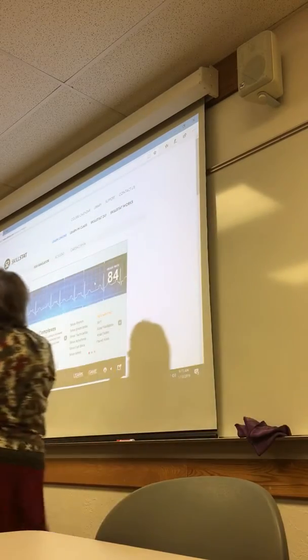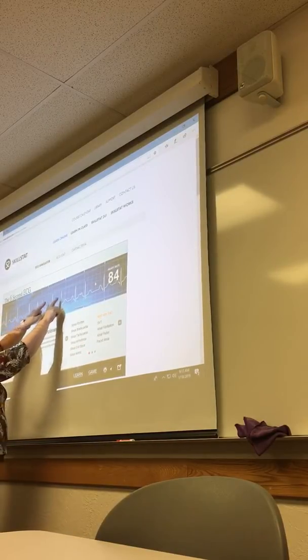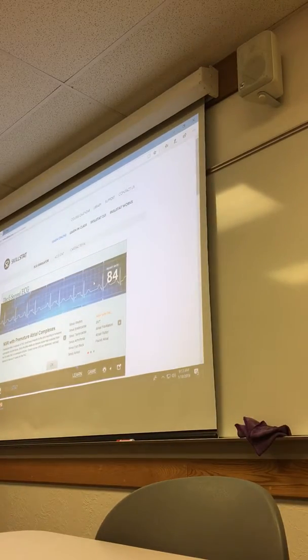And an easy way to find these is you've got a normal rhythm going off and then all of a sudden it's too quick. And so when you've got that premature QRS, you gotta look for what caused it, and there's often a PAC in there. So this is usually like an isolated section of it, not a continuous thing. Yep, just throws one here and there. So you can see this one, what are they doing? So we got a normal, normal, not normal, normal, normal, normal, not normal, normal. Yeah, so it's pretty random. So that's a premature atrial contraction.